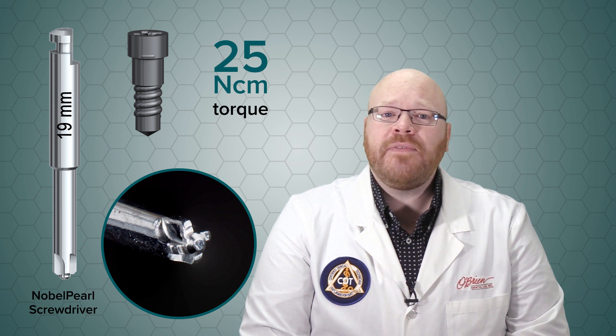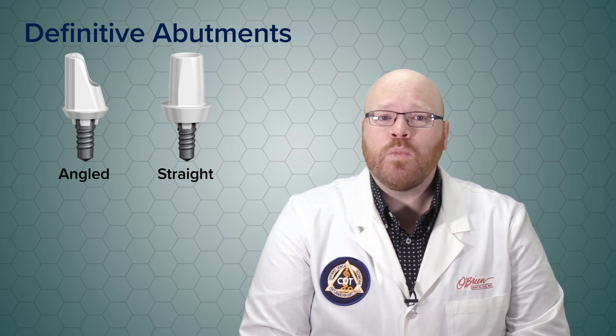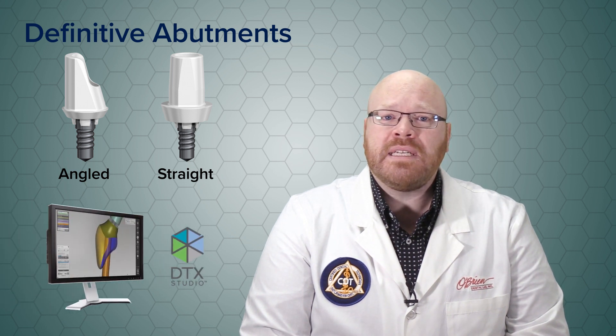Right now, the only definitive abutments available are the stock straight and angled abutments, but custom abutments will be available soon through the Nobel DTX Studio software.